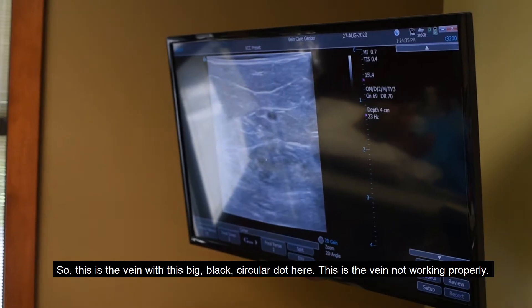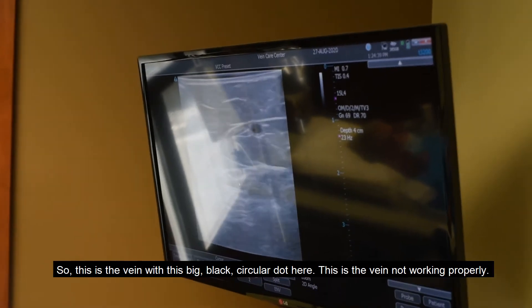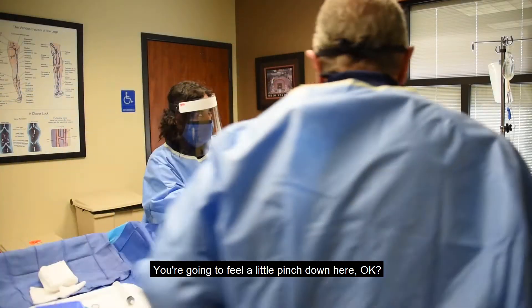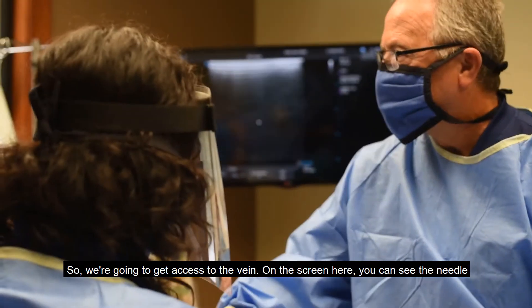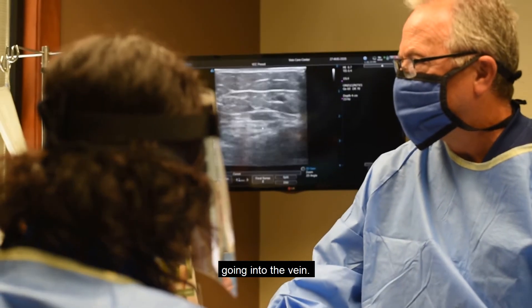This is the vein — you can see this big black circular dot here. This is the vein that's not working properly. You're going to feel a little pinch down here as we get access into the vein. On the screen there you can see the needle going into the vein.